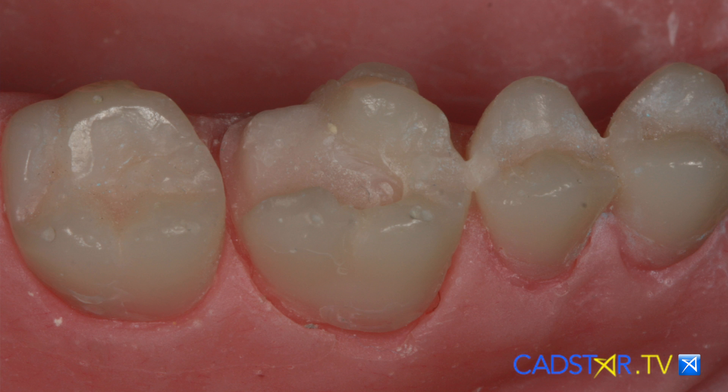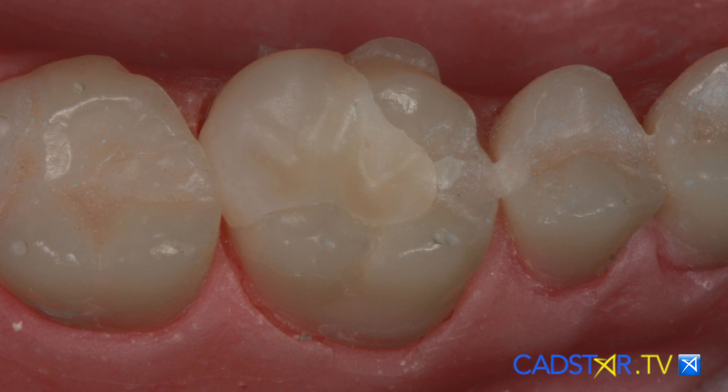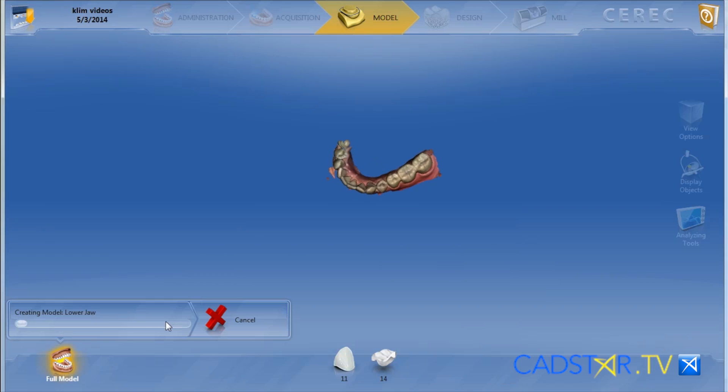There is an optimization of the algorithms for milling — phenomenal milled margins. In fact, I just did a prepless veneer the other day and I was at 0.1mm on the margins with no chipping, and that was Emax. So the milling has been significantly improved.